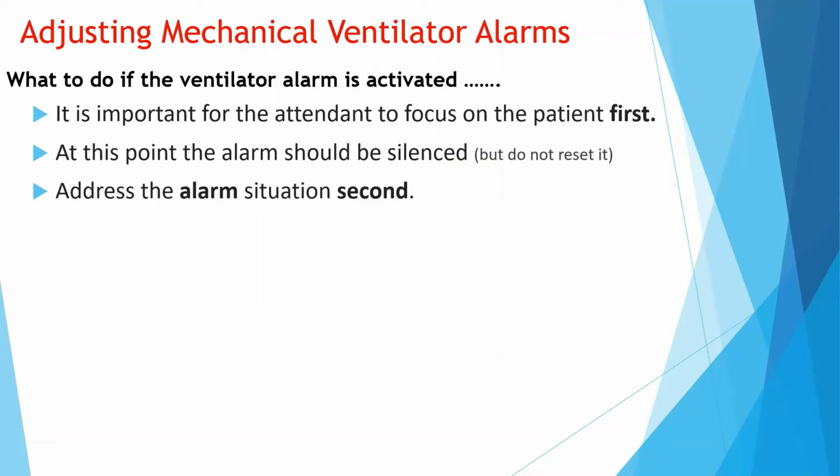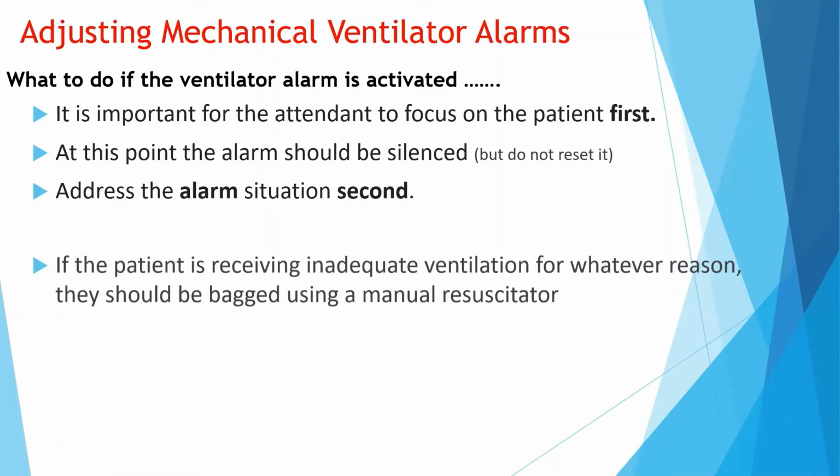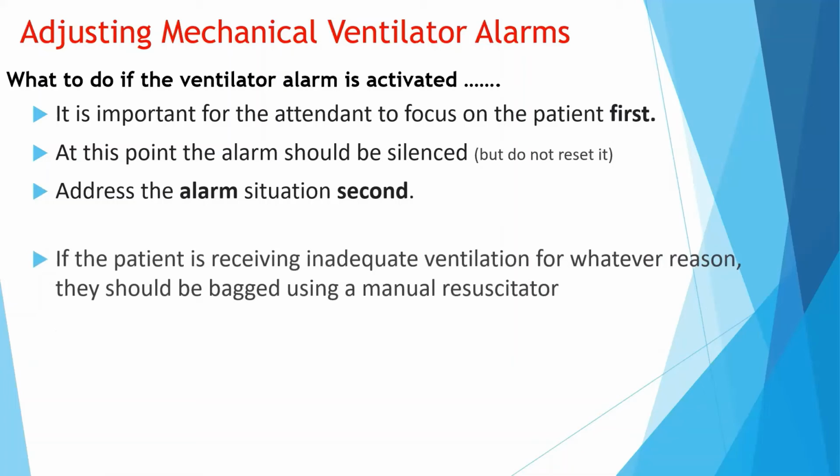So now's the time to decide what alarm was ringing and why it's ringing. Very often it's not that easy to find out and to come to a conclusion exactly what the problem is. If the patient is receiving inadequate ventilation for whatever reason, they must be bagged using a manual resuscitator with a flow of oxygen.